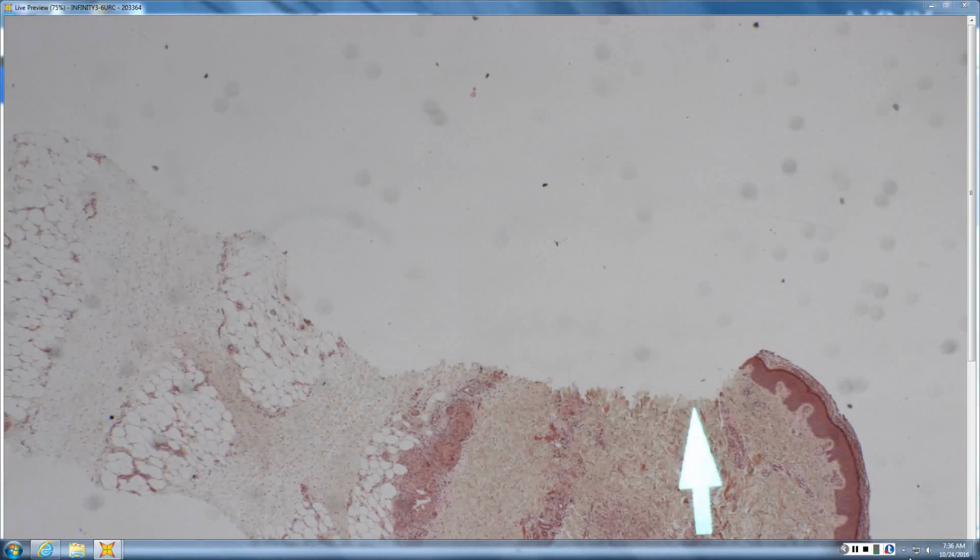The other thing is, see how your biopsy specimen looks like a mushroom with a broader top? You never see that in NLD because it's rock hard, so you get a rectangular biopsy specimen. Whereas when the tissue is normal, not sclerotic, you get this mushroom appearance where it's broader at the top because you squish it down. It catches the dermis but squishes everything else out of the way, so you end up with this mushroom look, which is normal. Sclerotic conditions, you don't get that. So it's a hint that this was not sclerotic.